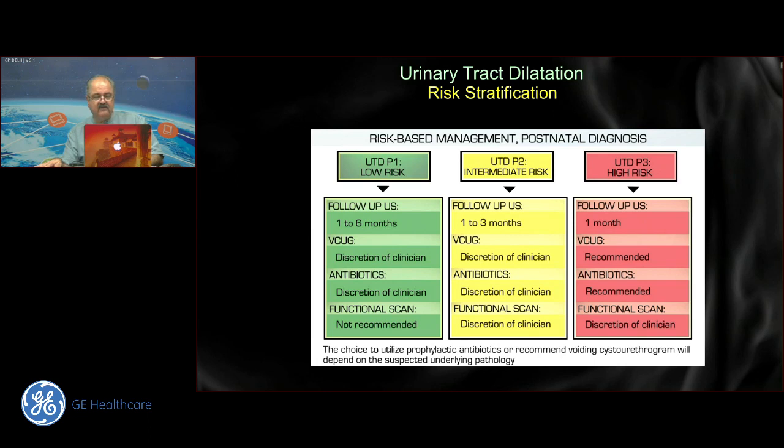Can unilateral hydronephrosis be considered a marker of genetic sonogram? It is. It is definitely a marker. It is one of the 8 findings. It has a positive likelihood ratio and a negative likelihood ratio, and we will use that as a calculation.